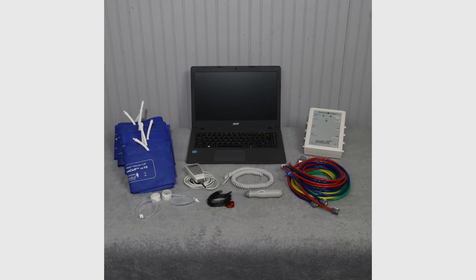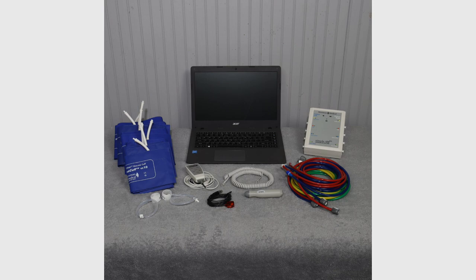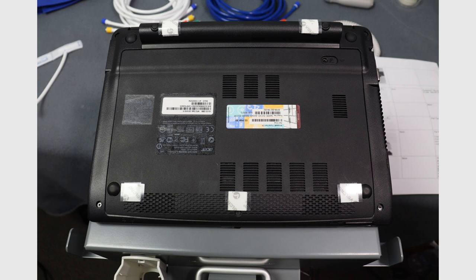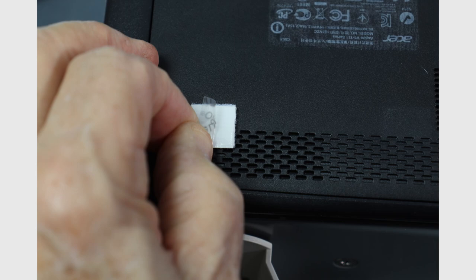Unpack the Neumann Medical Cufflink ABI system and arrange in an orderly fashion. The computer is attached to the computer tray using Velcro tabs attached to the bottom of the computer. Remove the material covering the adhesive and place in position.